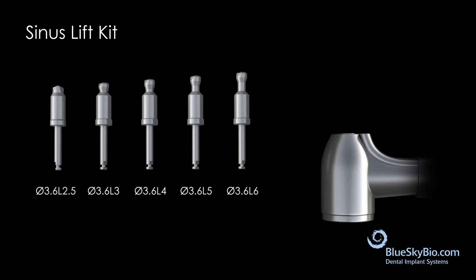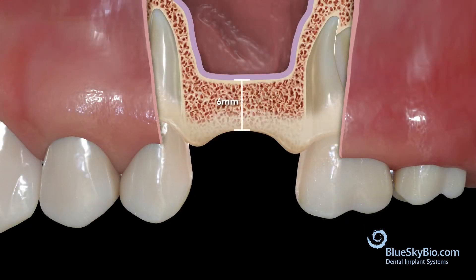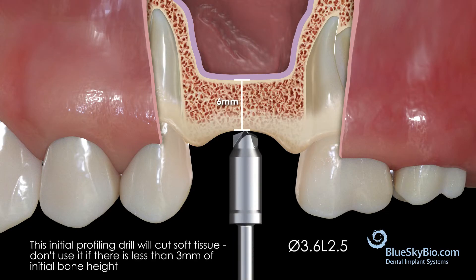This animation illustrates a case with six millimeters of native bone. Always start with the 3.6 by 2.5 millimeter long starter drill. It should be noted that this is the only drill in the kit that is end-cutting, and is only intended for profiling the ridge and creating an initial pilot hole. You should have at least three millimeters of initial vertical bone height when using this kit.